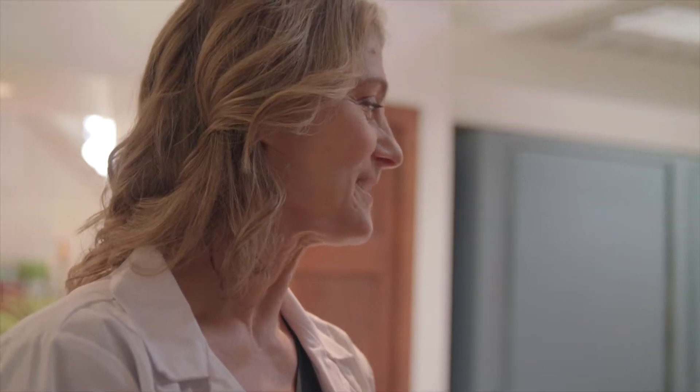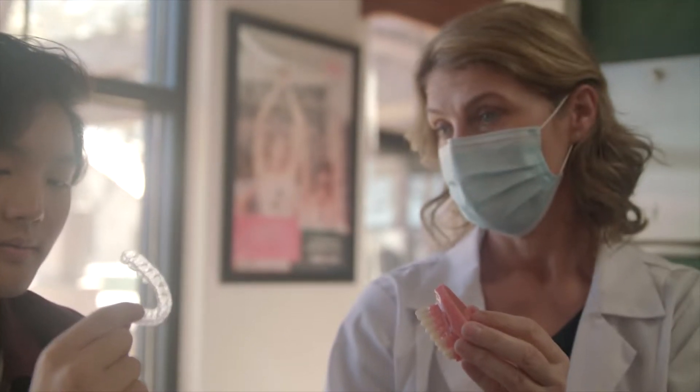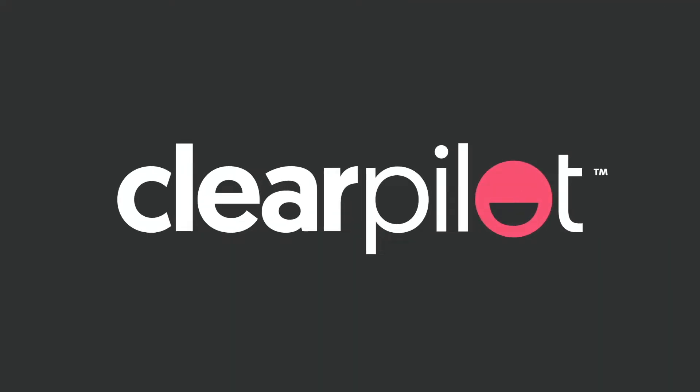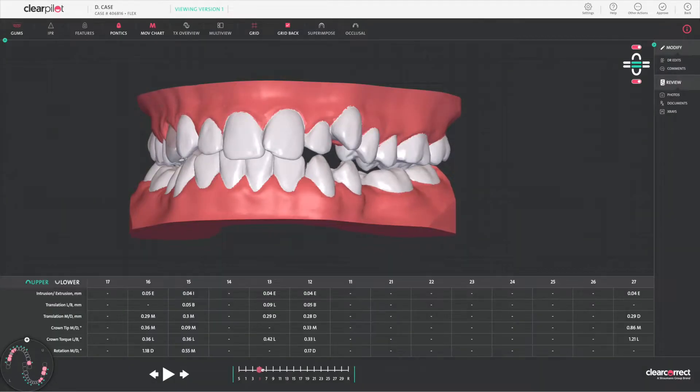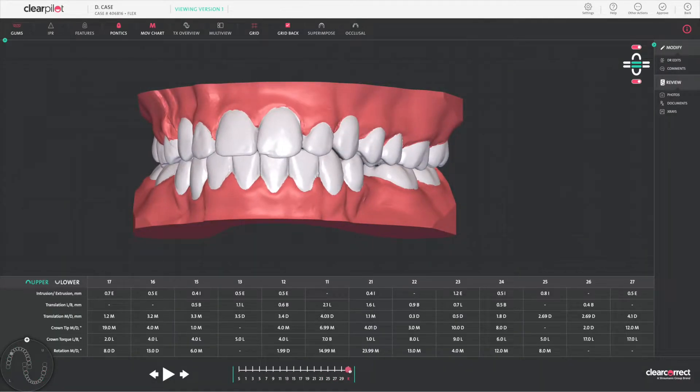As a clinician you need intuitive tools that empower you to treat your patients your way. That's why there's ClearPilot, ClearCorrect's treatment setup platform which empowers you with the flexibility and control you need to get the treatment outcomes you and your patients want.